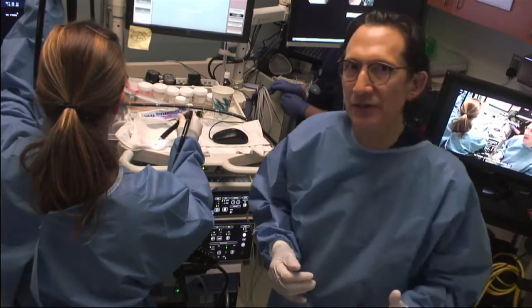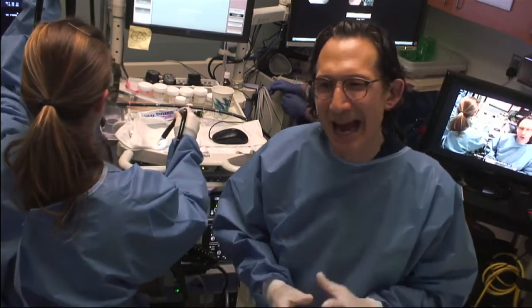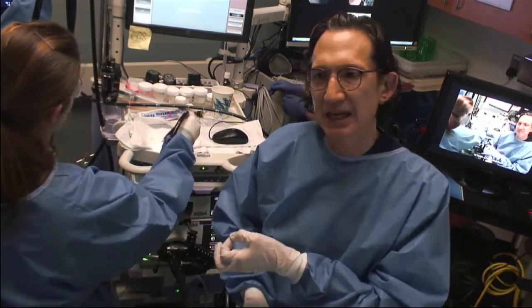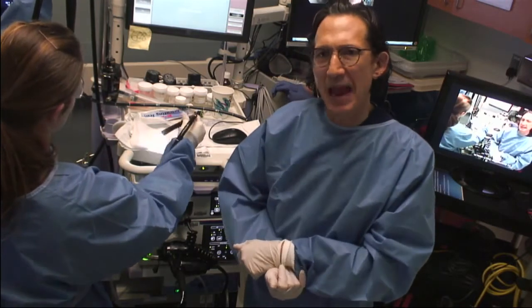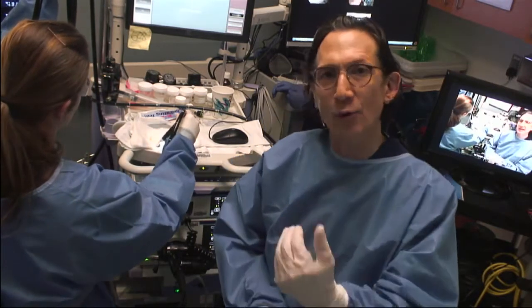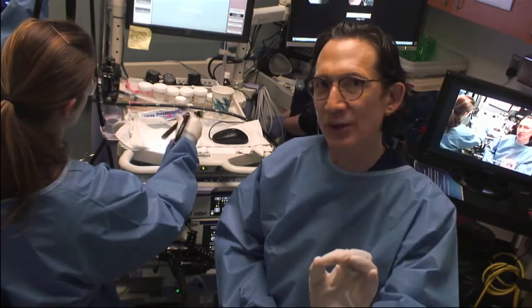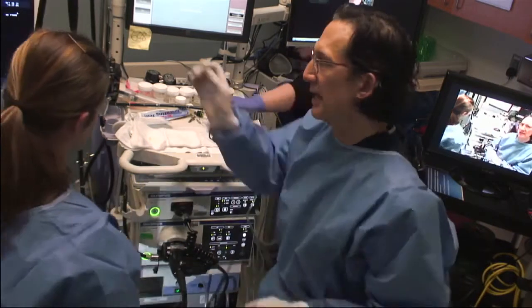The drawback of the forward view scope is the optics are not as good as our current generation of CLA echo endoscopes. Having said that, though, being a forward view scope, you can actually go into retroflexion with this scope and see the fundal varices, which is very difficult to do using the CLA echo endoscope.